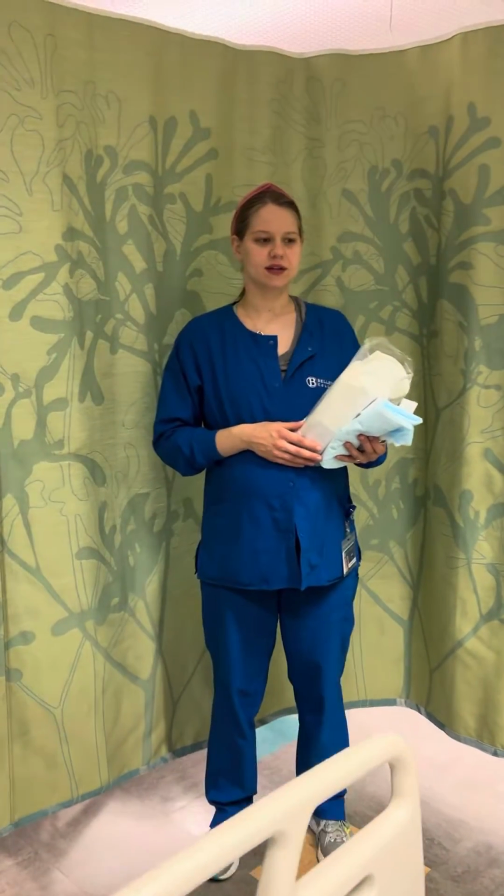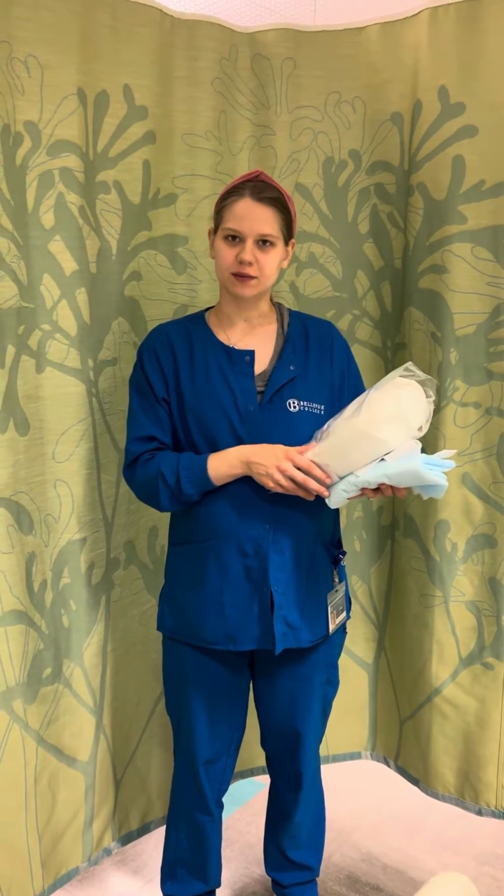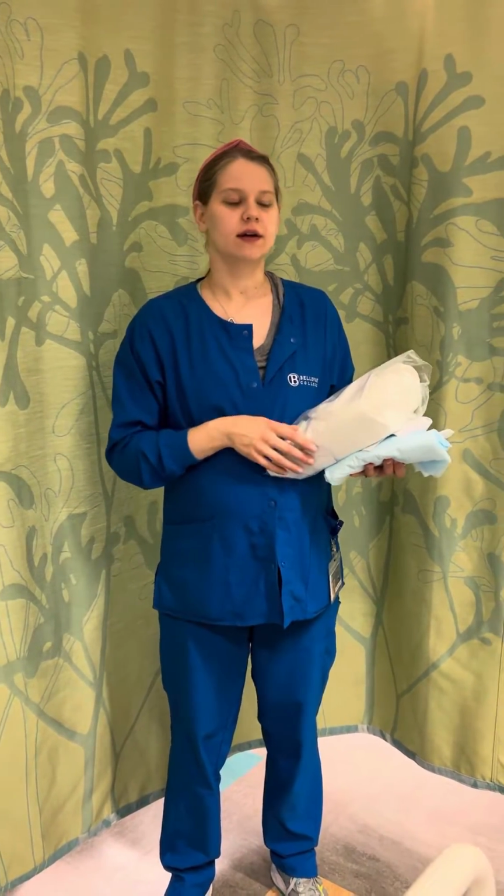Alright, there's an order for a Foley catheter insertion on my female patient. I've gathered all my supplies, I've double checked the order, and medicated my client 30 minutes prior and informed her of the procedure. Okay.